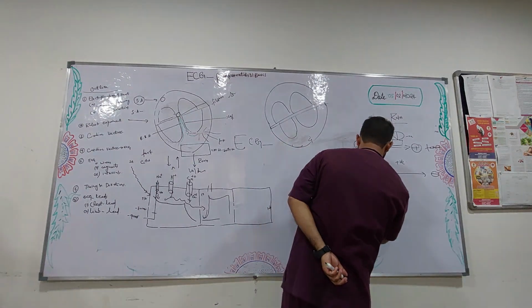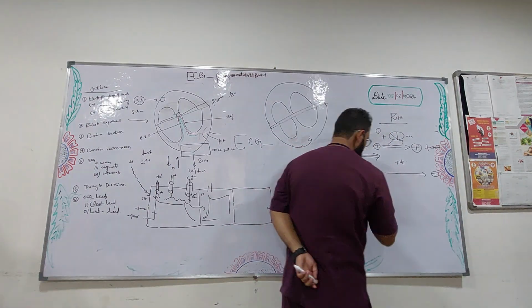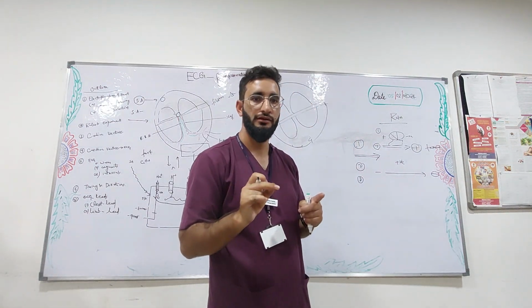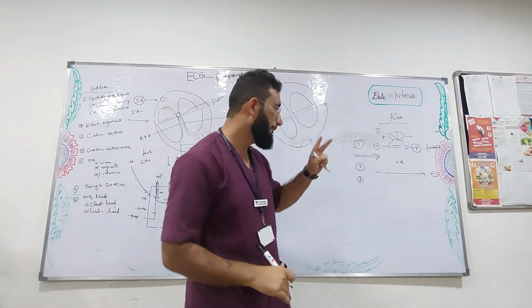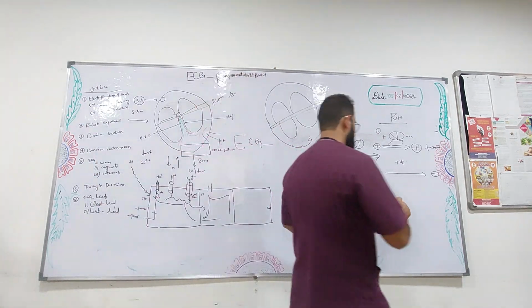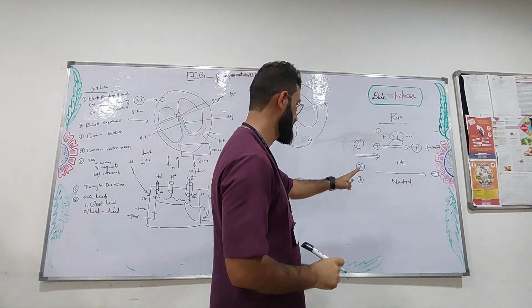The third rule: whenever there is complete depolarization, or resting membrane potential, that is repolarization, complete depolarization or repolarization, the deflection is neutral. This is the third rule.